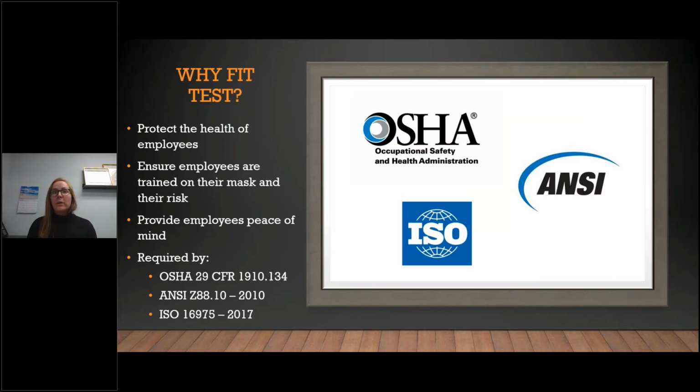So of course, we are going to fit test ourselves and our employees to ensure their health and safety, but in many places, we are regulated to do so. Fit testing as part of a complete respiratory protection program is a way to meet your legal obligations regarding respirator use in Australia. ISO is the foundation for many regulations. In the USA, OSHA requires fit testing. ANSI offers guidance on fit testing, and there's a forthcoming European standard, although I believe it too is going to quite closely follow ISO, or at least it appears to so far.